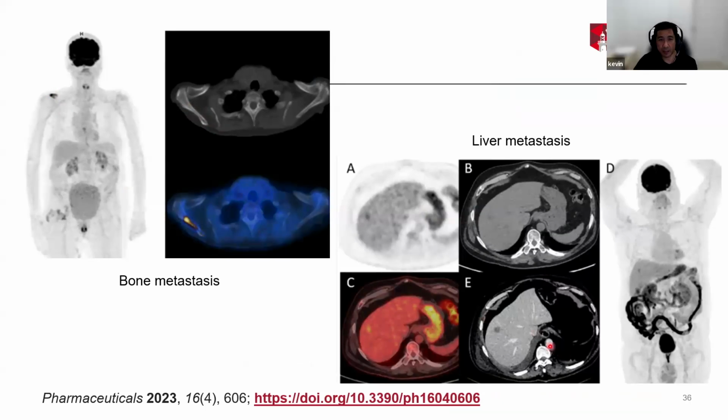And here's a deposit in the liver where we said, well, what is that? And someone may have said, Kevin, can you biopsy that? We don't know what it is. And I'll go, that's in a really difficult location. But the PET gives us the answer. Okay, that was all I was going to say about diagnostic things.